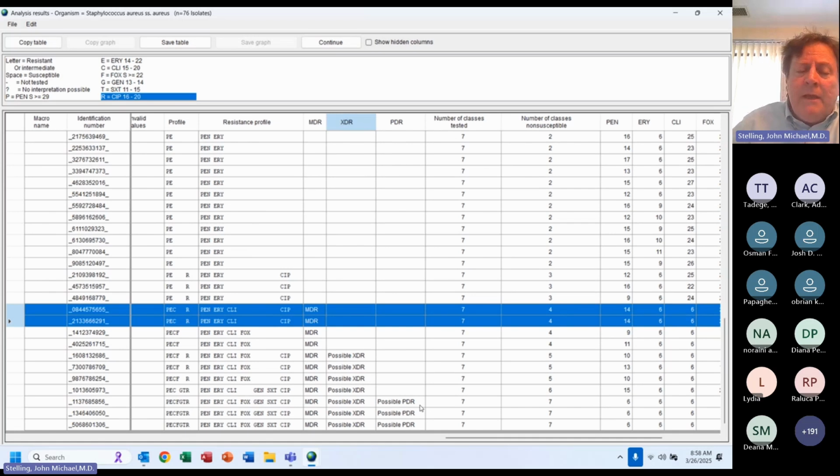So that's a different way. I like the WHONET approach if you're doing outbreak detection. For outbreak detection, you want to know which drugs are resistant and sensitive. The ECDC way, I think it's more for advocacy, awareness. Multi-drug resistance is important. It's an important public health threat, a therapeutic threat. So the focus is not on exactly which resistances, but how many resistances.